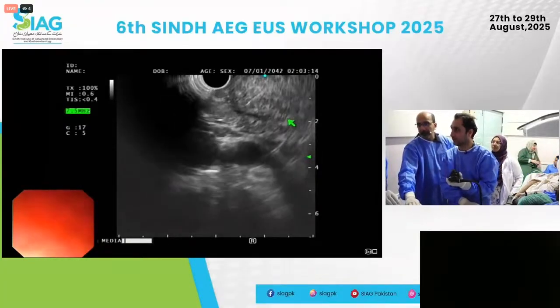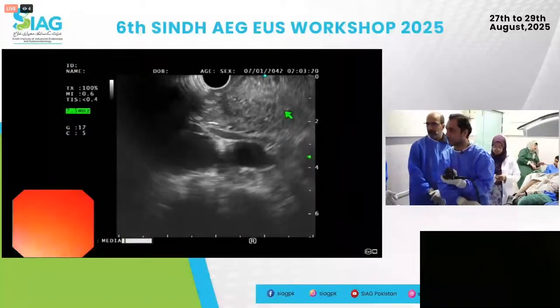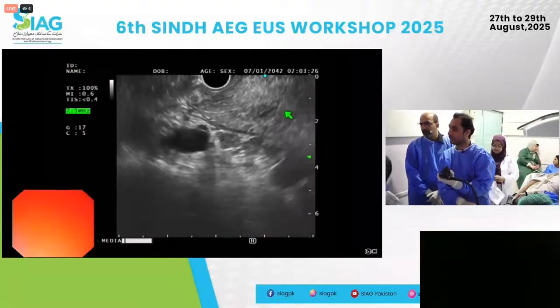Yeah, good. So keep following it. There you go. Good. Keep following it. Good. That's it. Keep pulling it back. And was it clockwise, or I think it was clockwise? There you go. Keep pulling back.